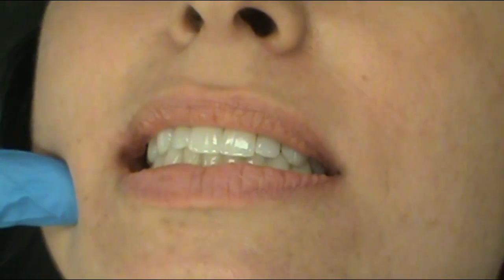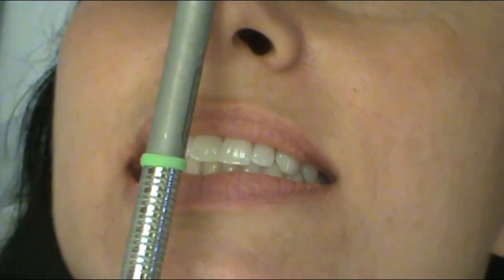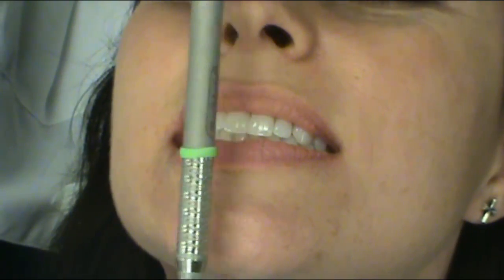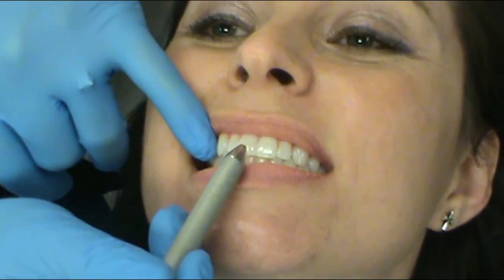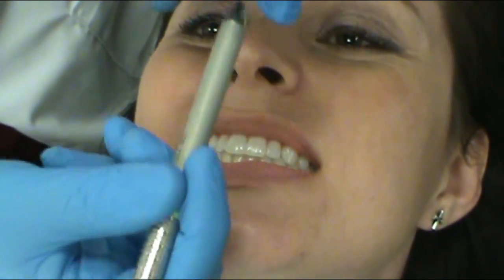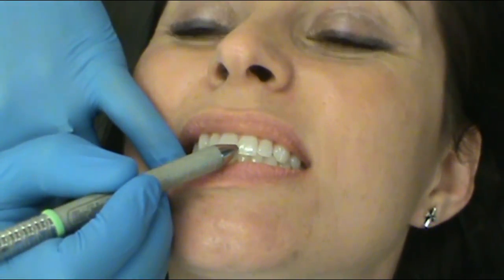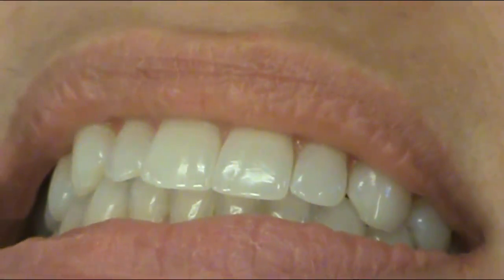The next thing we're going to look at, while she's still biting, is her midline. We can draw an imaginary line from the tip of Ms. Cruz's nose to the very center of her chin. What we want to see is that teeth eight and nine — the central incisors on the maxillary — have their interproximal area right in that imaginary line. We can also see the interproximal area of eight and nine articulating nicely with the interproximal area of 24 and 25. She does not have a midline deviation to the right or the left.